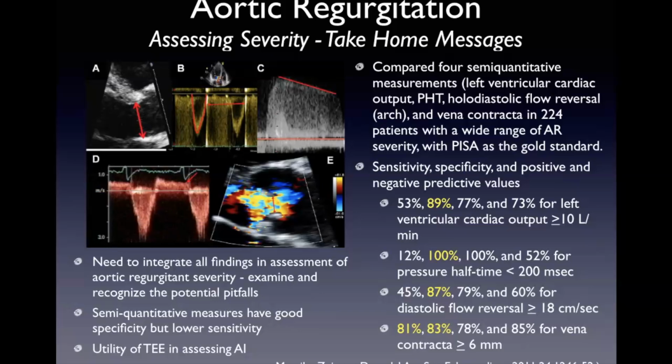Yes, Kathy. So for us sonographers, especially now that we're having new sonographers, can you please enlighten us why do we need to do contrast when there's significant MR and AR? Because some would think if they get nice endocardial definition, they can trace this for LVEF. Even most of us would say, okay, if we have significant MR or AR for volumes, we need to do contrast, even if you think the pictures are good.